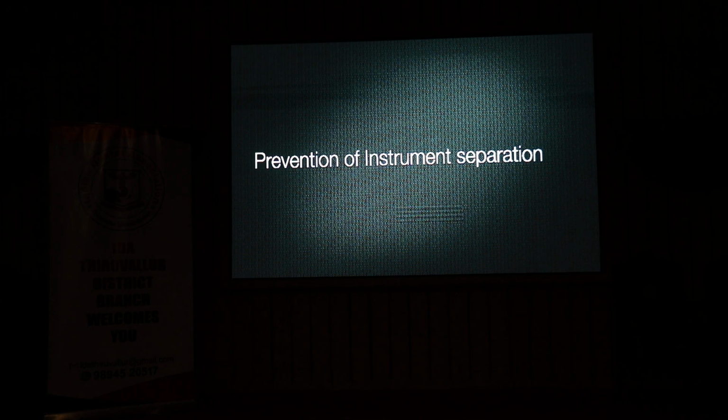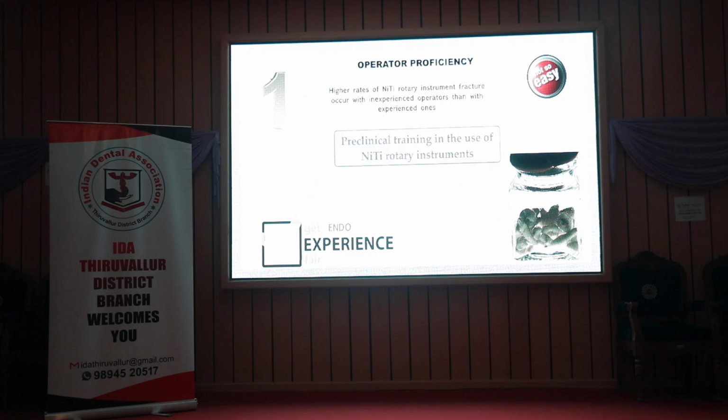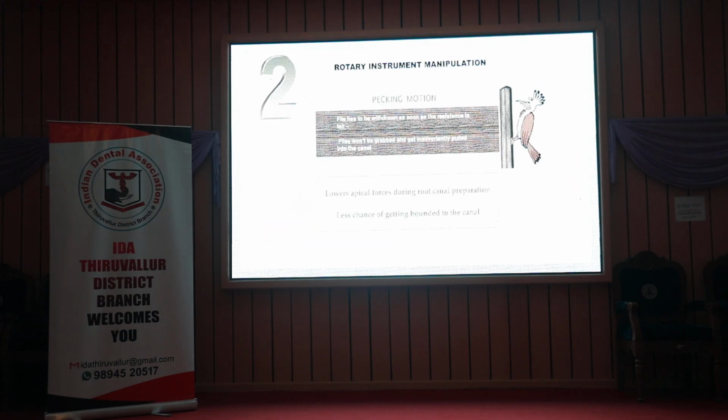Of course, the larger thing, as it is always in medicine, they say prevention is better than cure. So, if you are going to use any new rotary, currently the market is flooded with new rotary instruments, just understand the mechanism, try to practice on extracted teeth before you take it to the patient, and of course remember torsional fatigue. So you just move in and move out. In and out movement prevents that torsional fatigue. Use gentle apical force. They even say that it is like a lead pencil you will have to use.